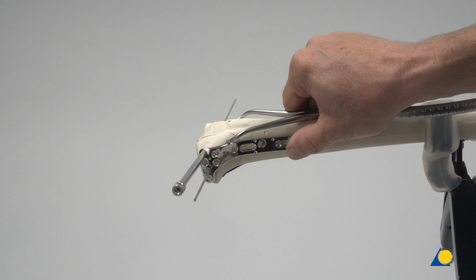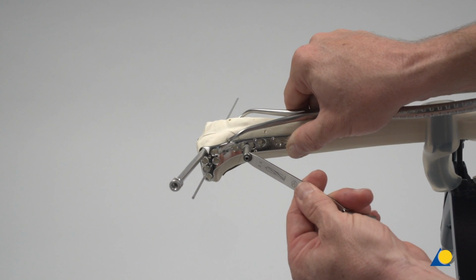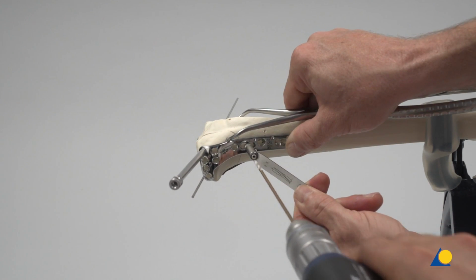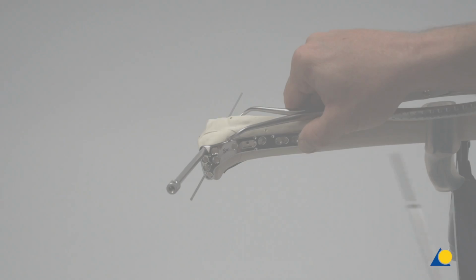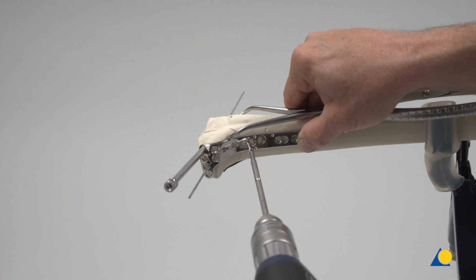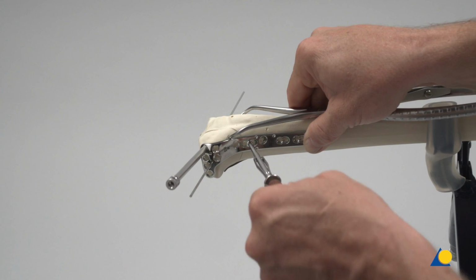The universal drill guide 2.5, 3.5 is positioned centrally in the long hole of the plate, and the drill bit 2.5 mm is used to drill a hole through both cortices. The depth is measured. Here, a 3.5 mm diameter, 48 mm long cortex screw is inserted, initially under power with the hexagonal screwdriver shaft, and final tightened with the hexagonal screwdriver.